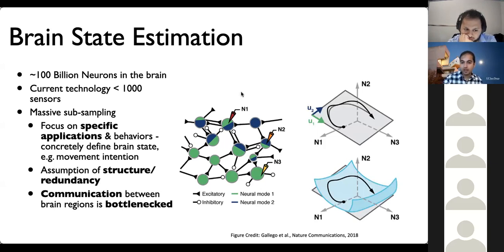And one of the key areas of theory that's advancing pretty fast in this field applies what's known as the subspace hypothesis. And the key idea is that when we look at neural activity within a brain region, we may be able to model it as living on a lower dimensional manifold within the higher-dimensional space of all of the neurons. So now, in this case, I'm subsampling to 3 neurons. Within those 3 neurons, I might be able to visualize that most of the variation, most of the activity of those 3 neurons lives on a 2D plane. Now, for convenience, many of the mathematical techniques that folks apply assume linearity, so that's why it's a flat plane. More advanced techniques may relax that assumption and allow for nonlinear manifolds within that space. And so you can imagine at a theoretical level, you have these manifolds that may describe quite a bit of the variation within a brain area.